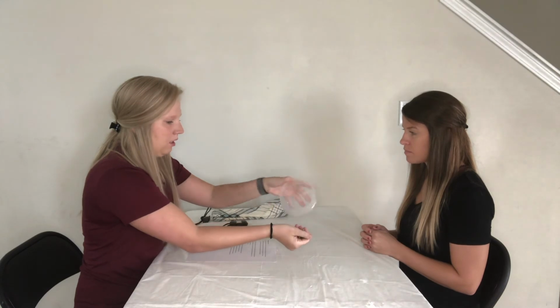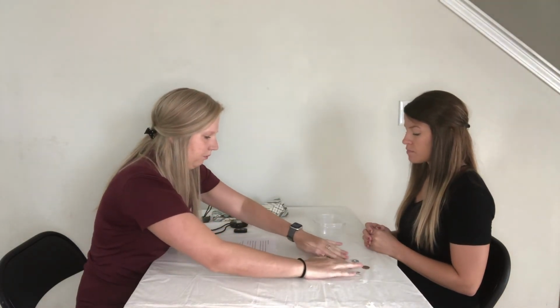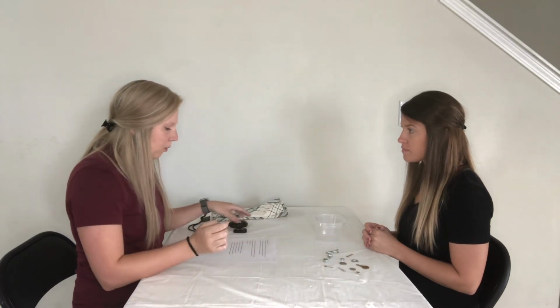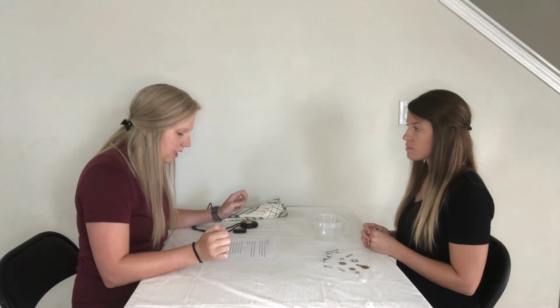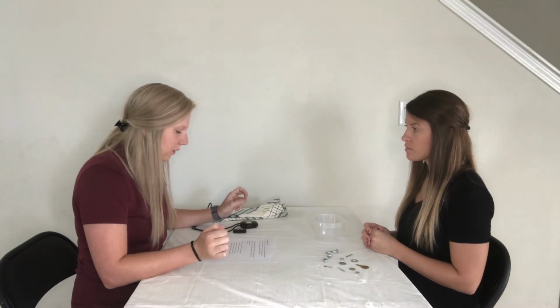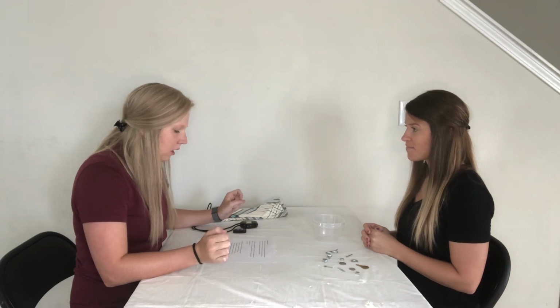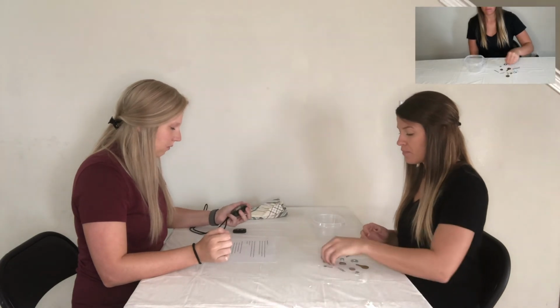Now we will be testing your left side. You will begin by picking up the items one at a time and placing them into the container as fast as possible. You are not allowed to slide the objects on the platform when picking them up. You may begin when I say go. Are you ready? Yep. Go.